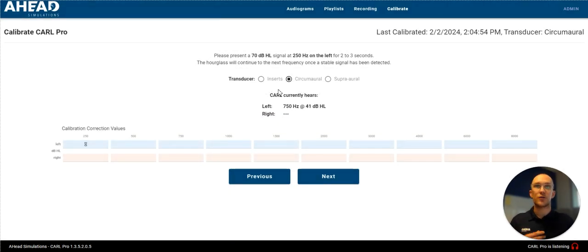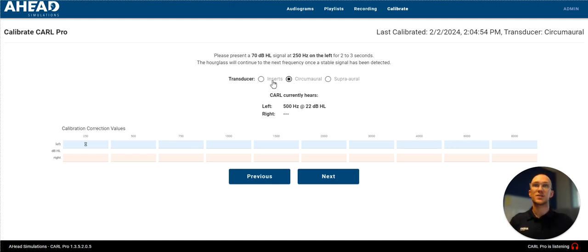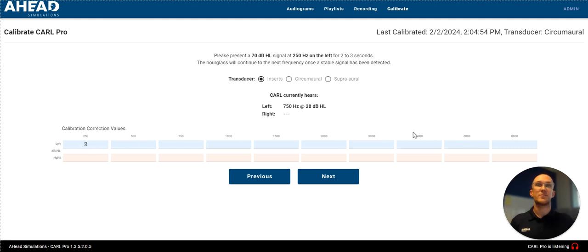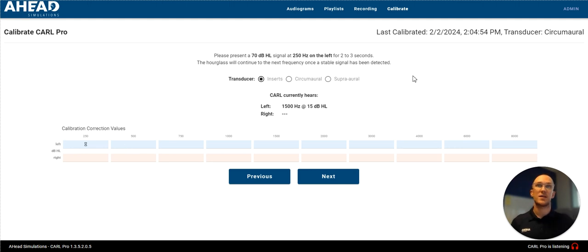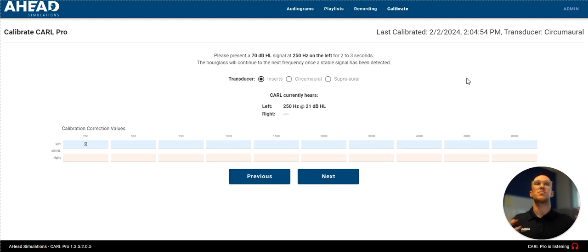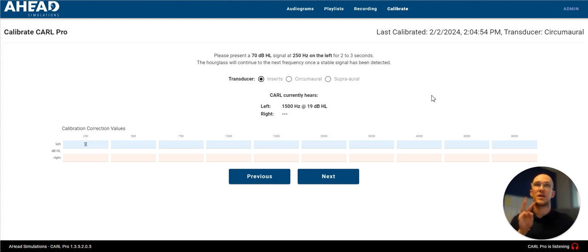I'm not going to go through a whole calibration because I already did that. But you can see I can choose which transducer I calibrate to. And then I'm going to present a 70 dB tone at each of these frequencies on the left and right ear. So Carl can determine he is hearing effectively. He's applying the right values to what he's hearing and he's ready for a hearing test. So that's number three, calibrating your Carl.